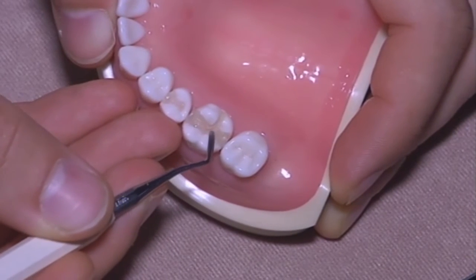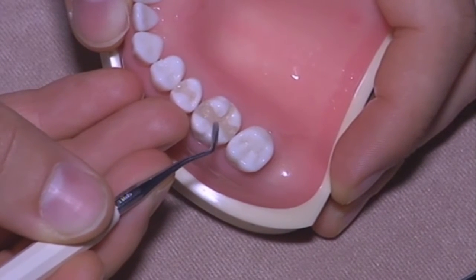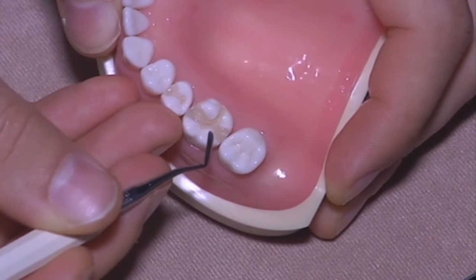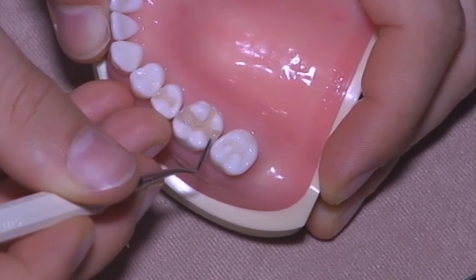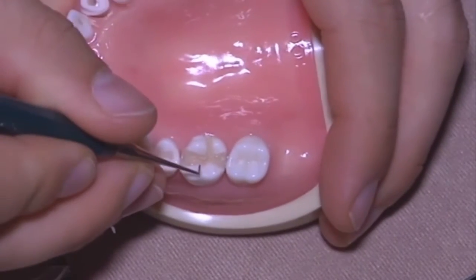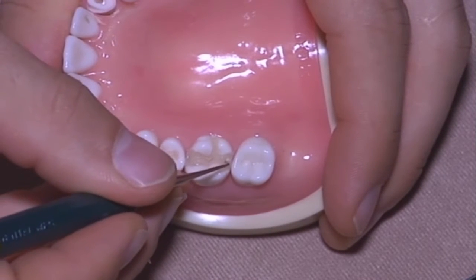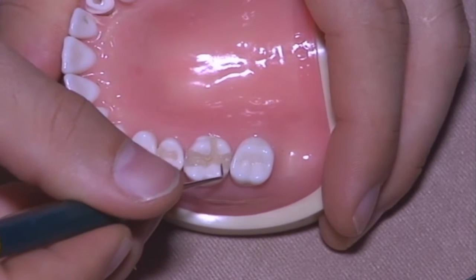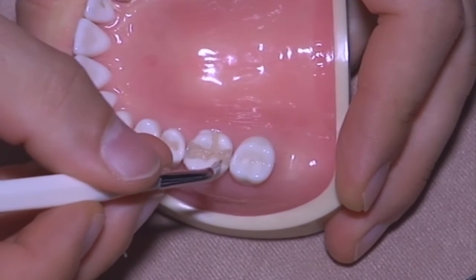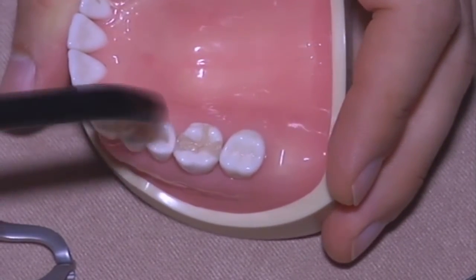It's gonna take you 5 minutes more working cusp by cusp now, but it's all time which is saved in the occlusal check, because you can work better in giving the right shape, which is automatically an advantage in occlusal contacts. That's it.